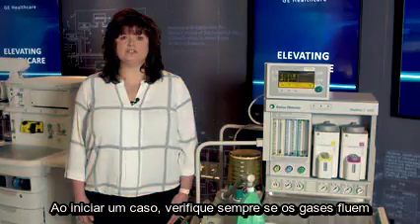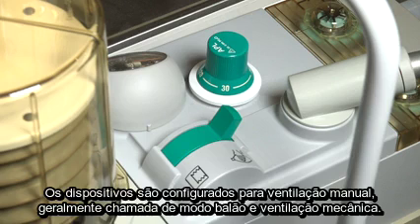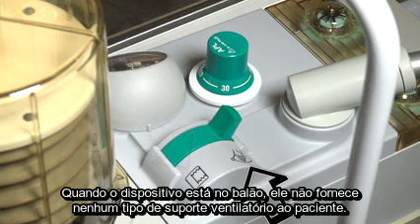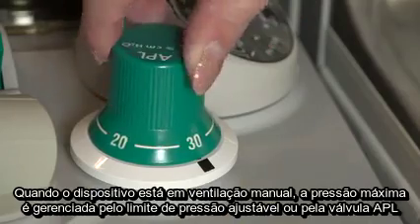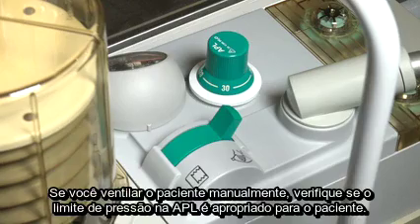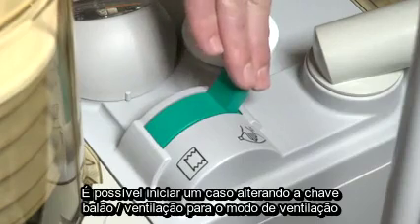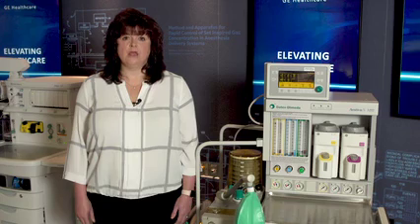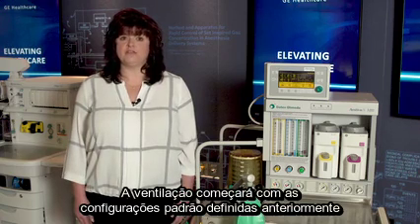When starting a case, always ensure gases are flowing. Anesthesia devices are not automatically configured to begin mechanical ventilation when a case is started. The devices are configured for both manual ventilation, often referred to as bag mode, and mechanical ventilation. When the device is in bag mode, it is not providing any ventilation support to the patient. When ventilating the patient manually, maximum pressure is managed by the adjustable pressure limit or APL valve. Ensure the APL pressure limit is appropriate for the patient. A case can be started by switching the bag-to-vent switch to vent mode. Before starting a case, please verify the settings are clinically appropriate. Ventilation will begin at the previously configured default settings.